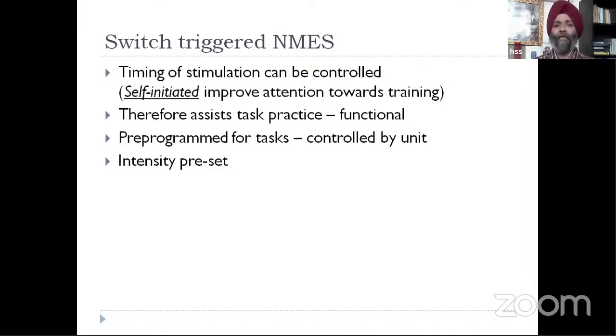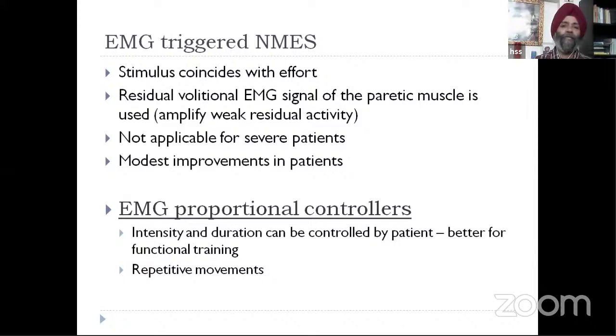So some part became interactive, initiated by the patient, but another aspect of the treatment characteristics remained out of the control of the patient to change or modify within or during the movement. So the intensity and the tasks were pre-programmed. Based on that, and looking at the drawbacks of such type of stimulation, there were developments in the use of currents, and one of them was the EMG triggered functional stimulation.